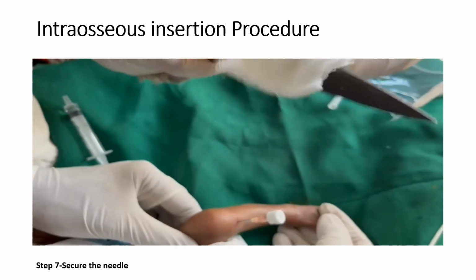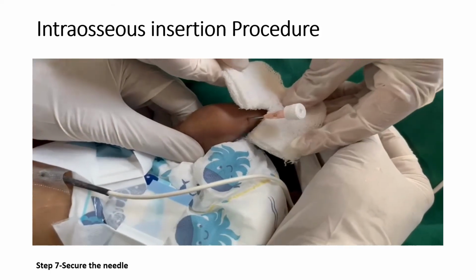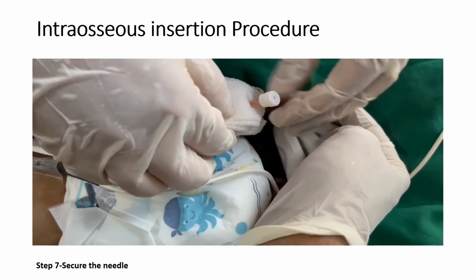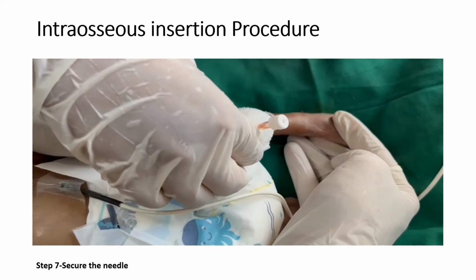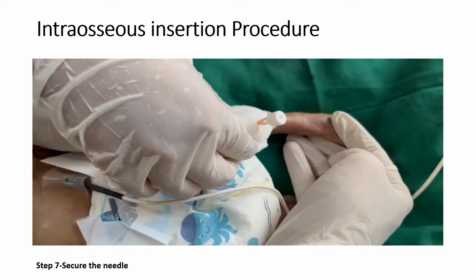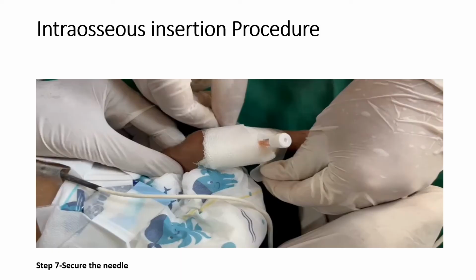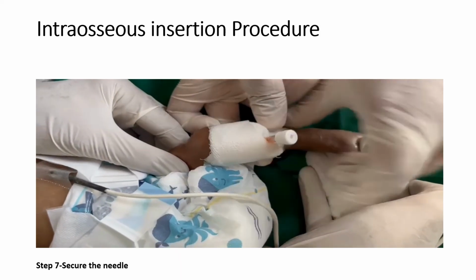And after that you have to fix it in this way. Then put the adhesive above and below to secure the needle.